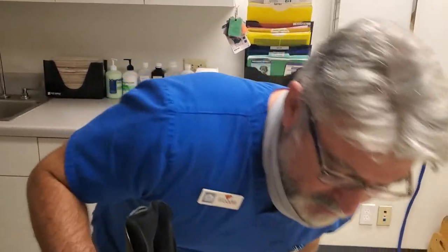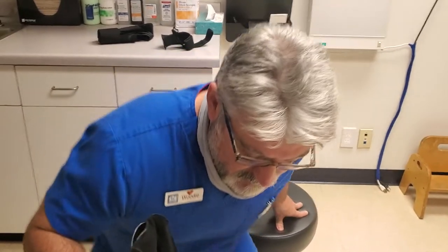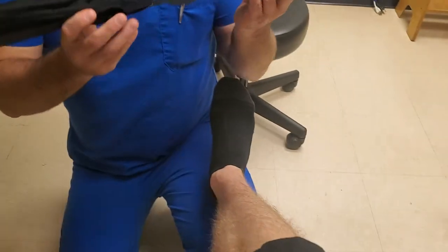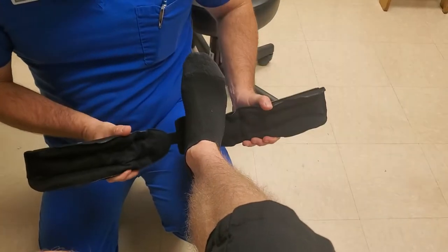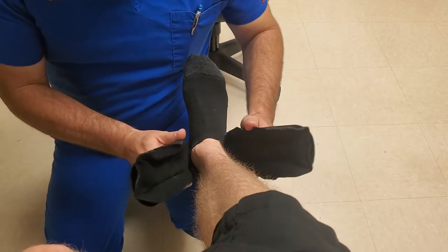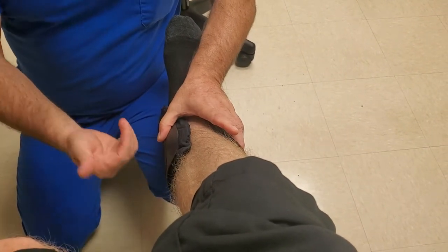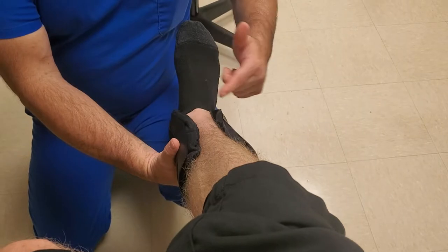I'm going to go ahead and take a knee. Give me your foot right there. What we're going to do, I'm going to place that heel pad right at the center of the heel on the bottom. We're going to bring this up right along flush with the ankle bones and we're going to make sure that it's nice and parallel with the tip fit.